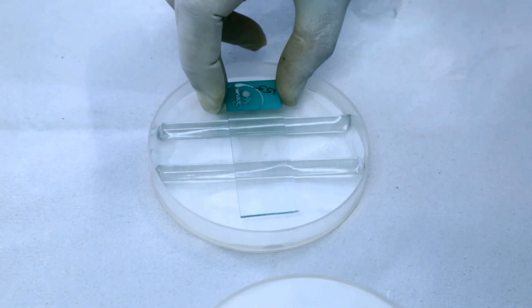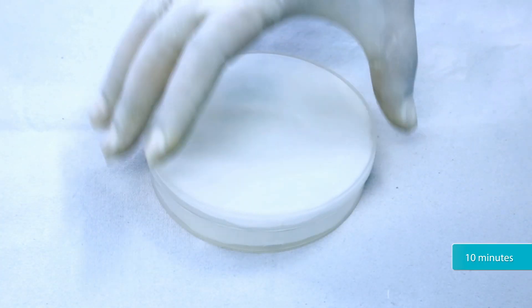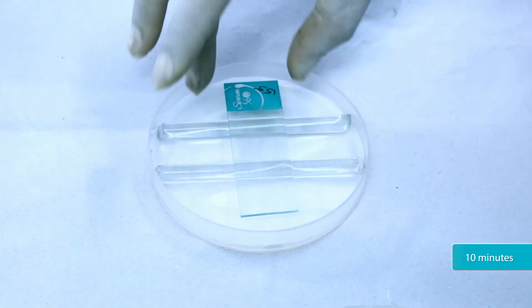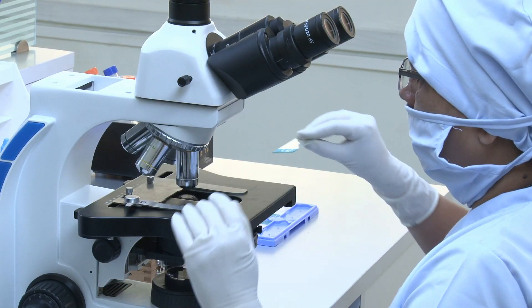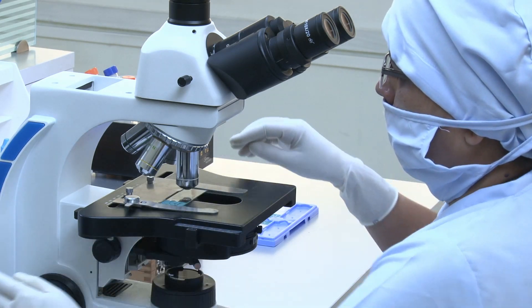Place the slide in the petri dish and incubate for 10 minutes. After 10 minutes, observe the smear under a phase contrast microscope using the 40x objective lens.